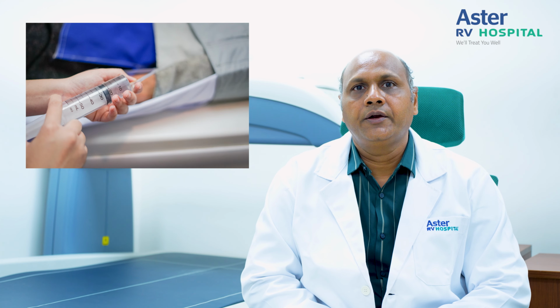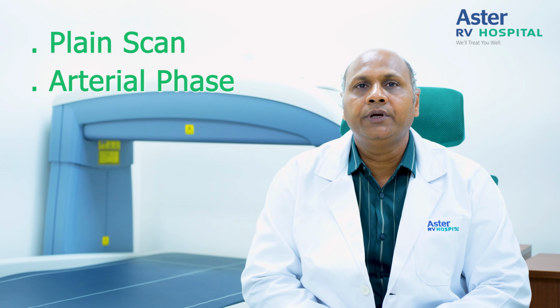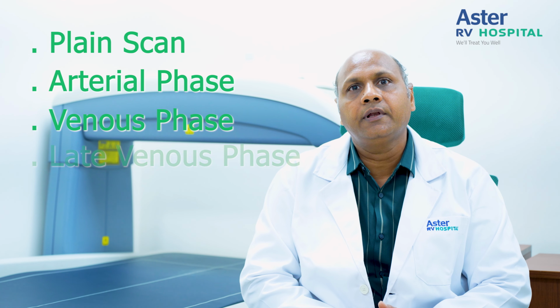So CT angiography is a form of CT scan where we inject intravenous contrast into the body, and at the same time we acquire CT scan in different phases. That is the plain scan, then we do it in the arterial phase, the venous phase, and the late venous phase. So in this manner, we can look at the arteries of the brain or the body, the venous system, and the delayed venous system. So we get good information about the arteries and the veins of the body.